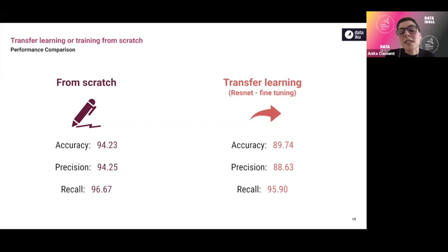And so as you can see, I got pretty high recall, I would say, almost 96%. But then precision was actually quite low, and so was accuracy. So it's kind of an okay model, but obviously in real life, we could never use this kind of solution for actually doing the pneumonia detection. So I'm not doing an apple-to-apple comparison for transfer learning. Just try fine-tuning, just train on 25 epochs. Didn't really try to optimize anything, but it was just to get a second baseline in terms of what kind of performance I can get in just a few days, basically.